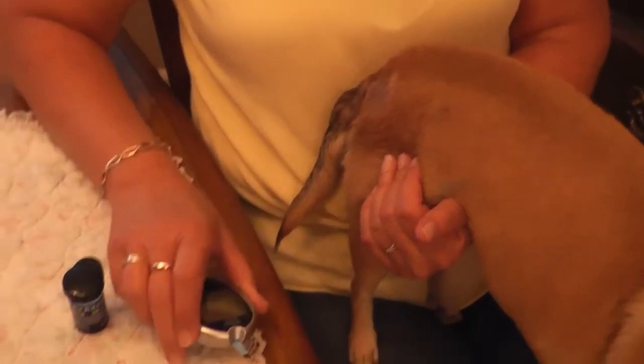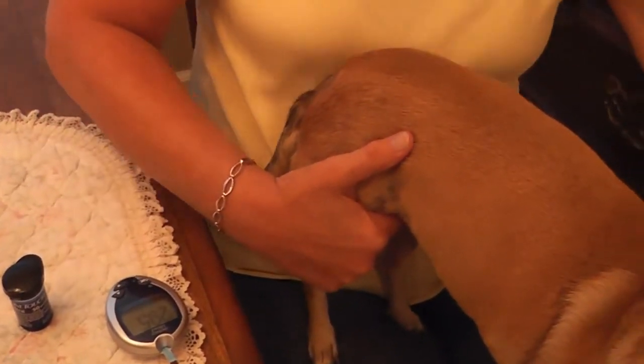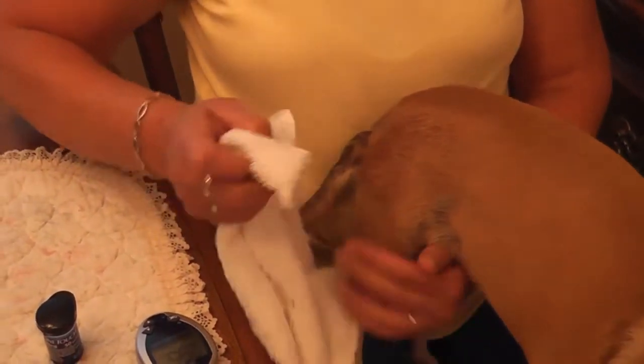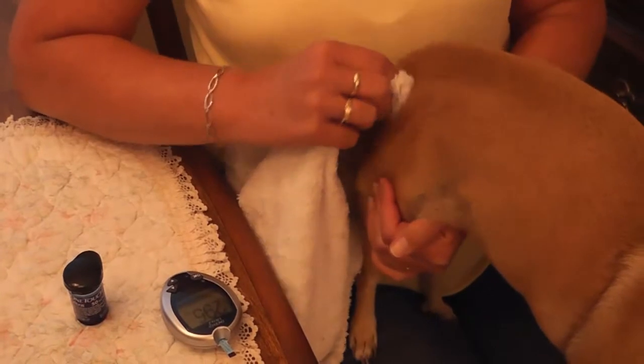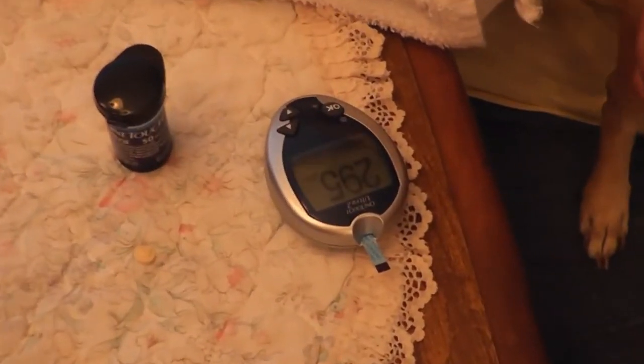Suck it up into the strip. She just ate, and she's 295. It didn't bother her at all — she's all done.